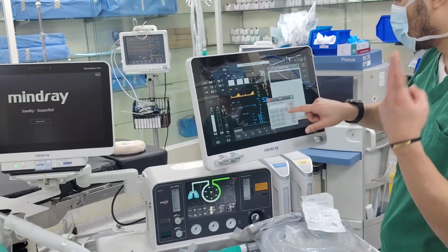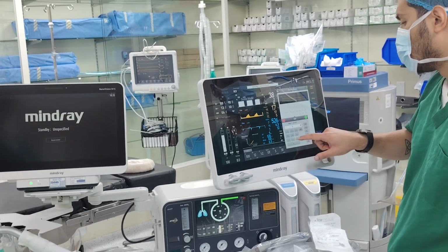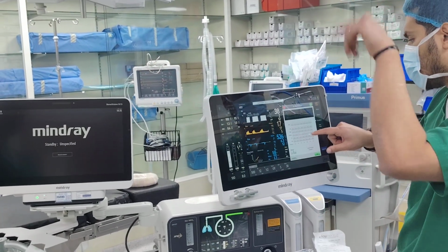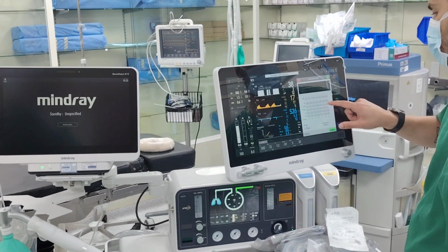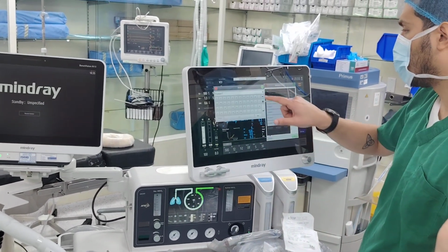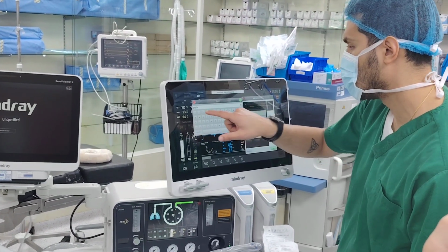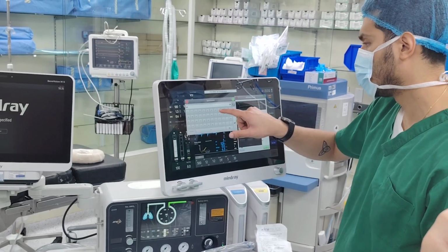I will increase the PEEP by 2. So I will start with 5, 7, 9, 11. Okay, like stairs. Then I go downwards. 9, 7, 5. I will save this procedure as PEEP 5 plus 2. So you guys can remember. Please 5 plus 2. Confirmed. Created.